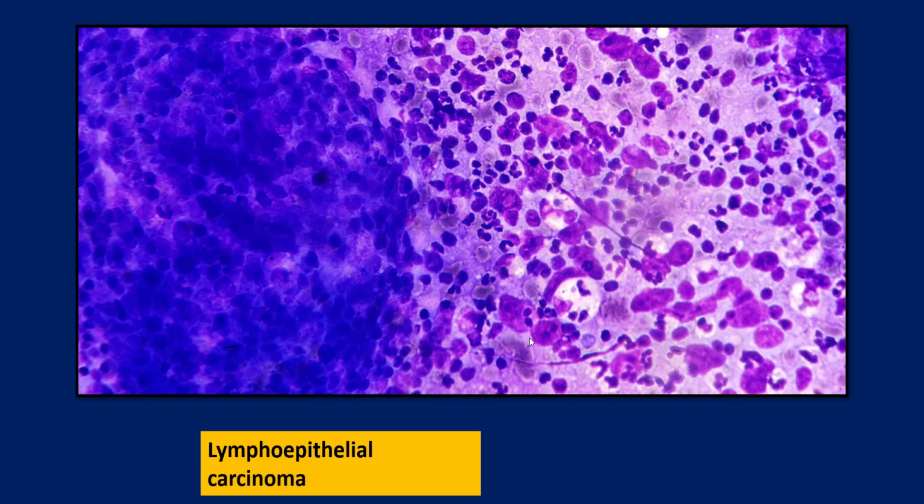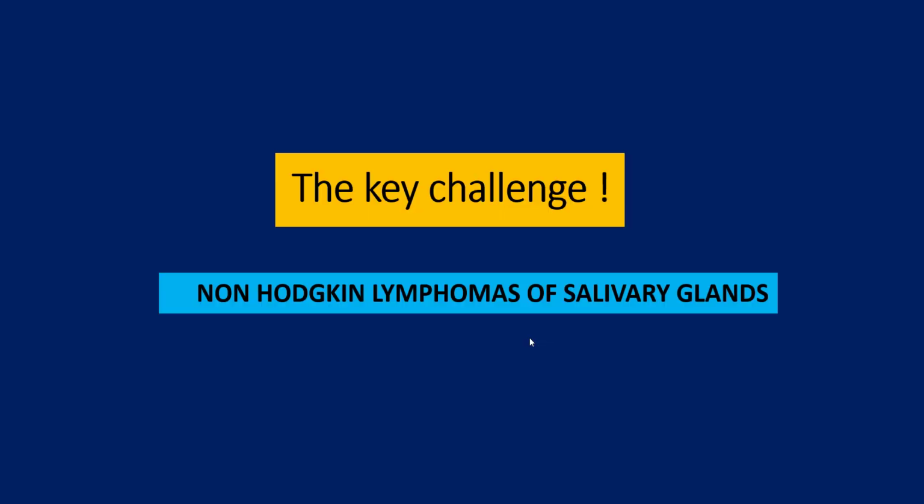This happened to be a lymphoepithelial carcinoma. So another one of your differential diagnoses. But what is the key challenge? The key challenge is the non-Hodgkin's lymphoma of the salivary glands.